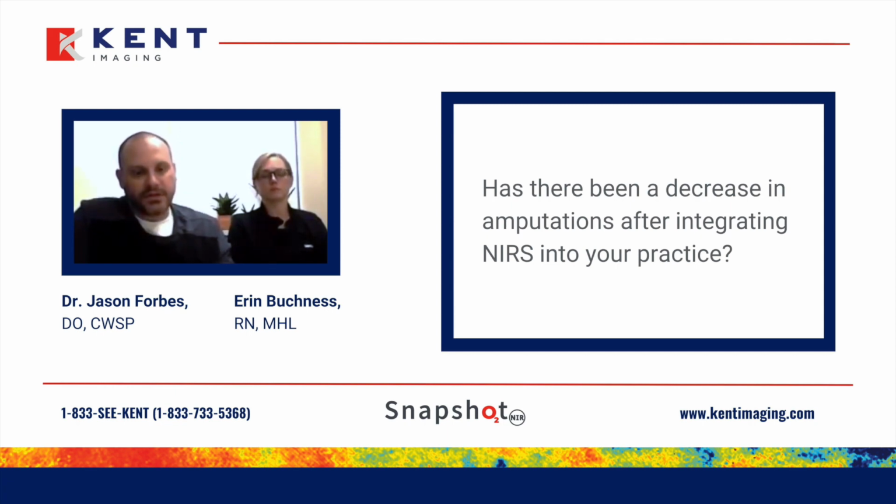And so then I can be more aggressive in my intervention, not just wait, because at this point you think, well, let's give it some time. It's looking okay today. Come back in a week. Well, a week later, it's necrotic and it's dehisced, and then there's early gangrene, and there might be osteomyelitis, and all these things that could have been avoided if you could have objectively seen there's a problem here. Let's do whatever intervention as aggressively as we can. So whether that's hyperbarics or get them back to vascular to talk about, is there anything else you can do here and avoid the major amputations? That's all we're looking for, is how can we avoid you having to have a below knee or worse amputation.